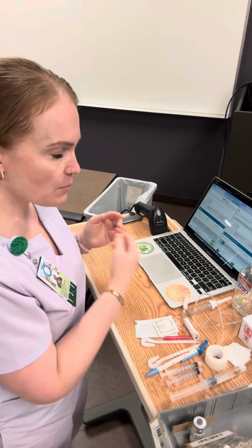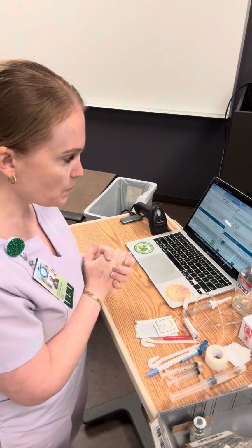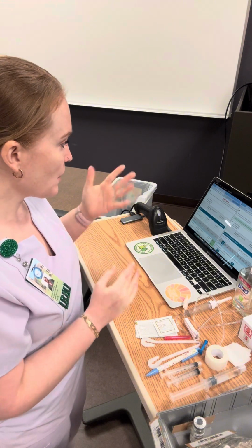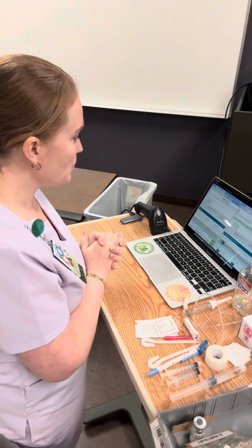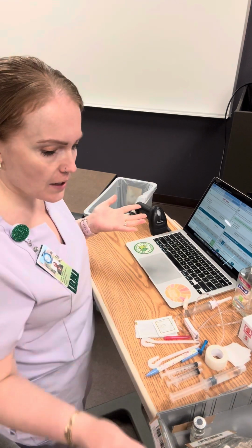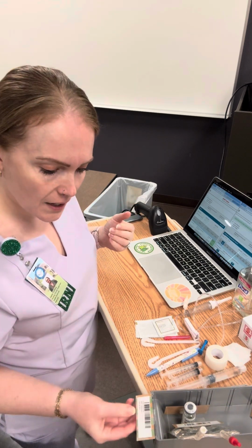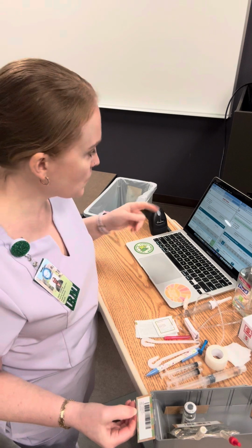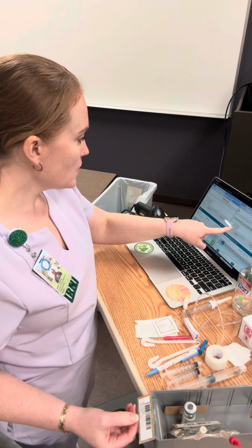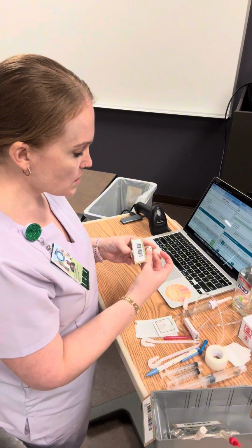I have my pen, I have my med cards, I have my EHR tutor pulled up, I have IV tubing, I have my medication bin, and everything is in the order that I am prepared for. So I have my orders up here and I have my MAR up here. I'm going to make sure that I have verified that I have the right patient for my MedCheck 1. I have Miss Code Brown here, 61851 in my orders, Code Brown 61851, and in my MAR, Code Brown 61851. I'm going to first start with my IV push medication, which is ondansetron.